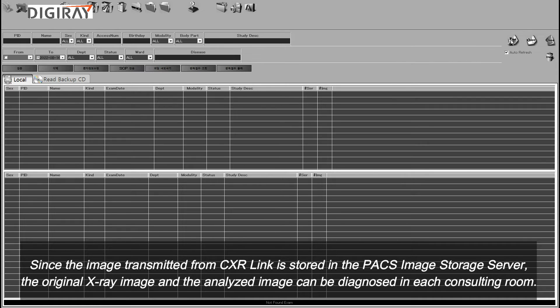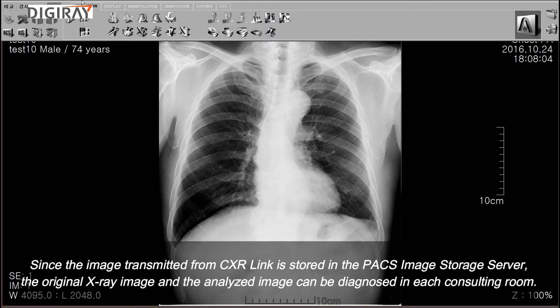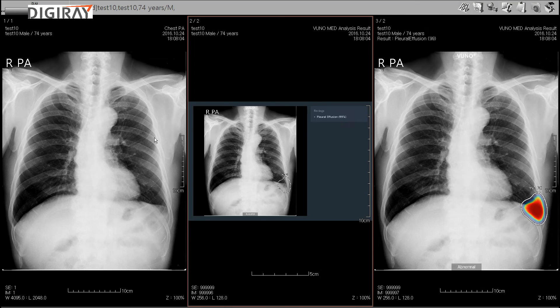Since the image transmitted from CXR link is stored in the PAX image storage server, both the original X-ray image and the analyzed image can be diagnosed in each consulting room.